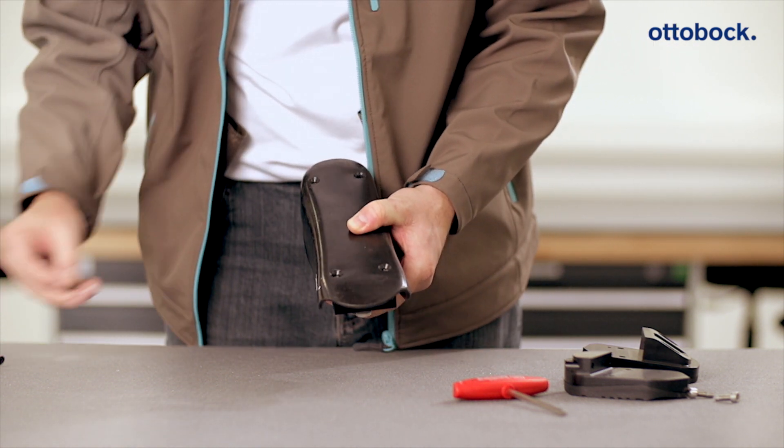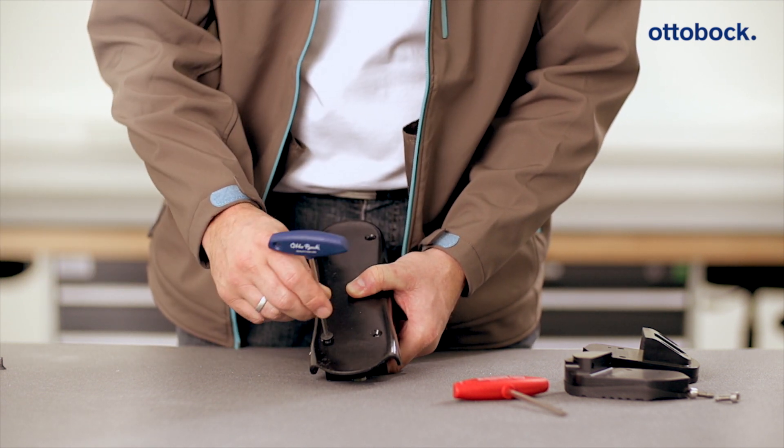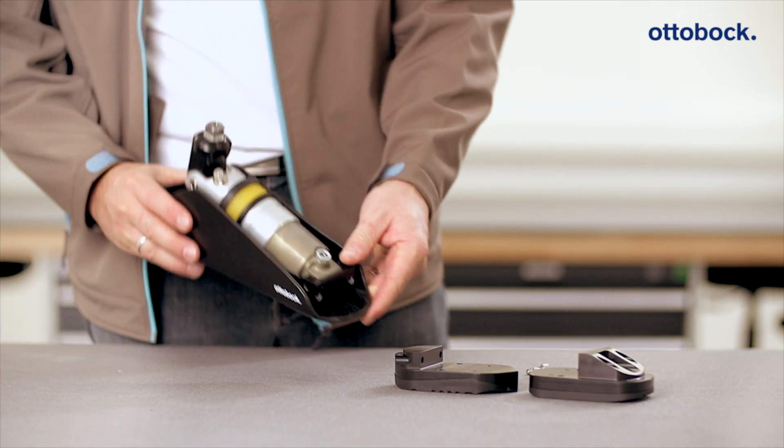For this purpose, use the supplied ProCarve components in combination with the approved adapters according to the system overview in the ProCarve instructions for use.